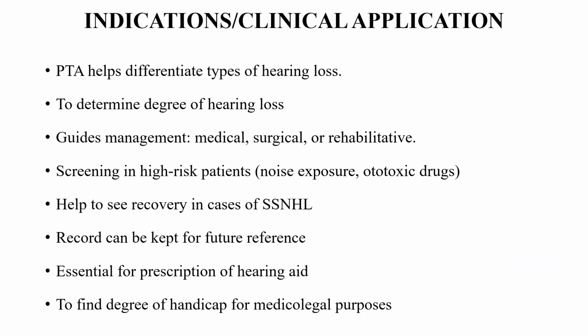So there are certain indications and clinical applications while performing pure tone audiometry. First and the most important is to detect the hearing loss, its type and its degree. So PTA helps differentiate different types of hearing loss, and it determines the degree of hearing loss.